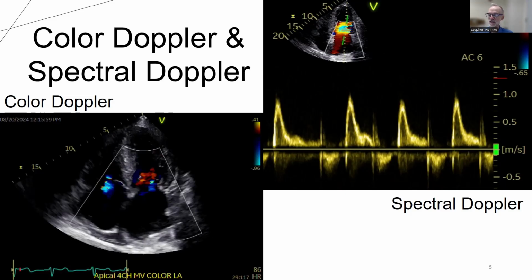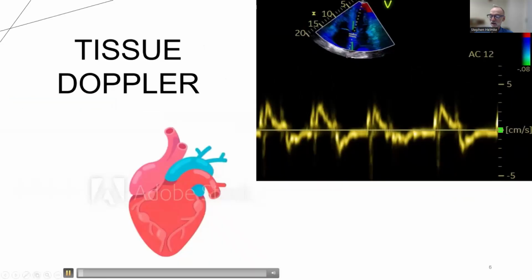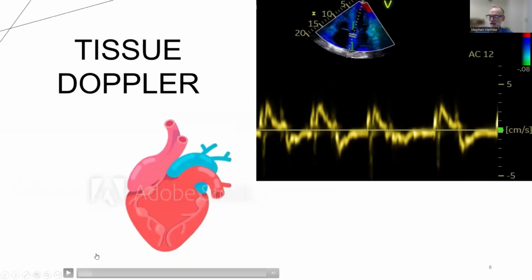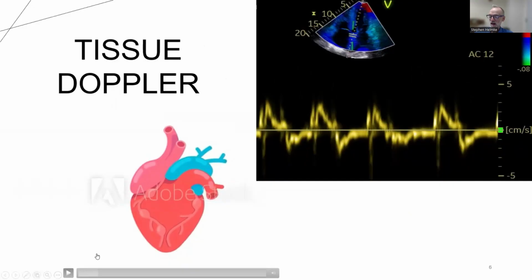I'm going to show a little animation to get us thinking about the way that the heart moves. As you see from this little cartoon here, not only is the heart squeezing, but where's it going? My little cartoon stopped. Come on. Well, you can see as it squeezes, it bounces down, and then it bounces back up.